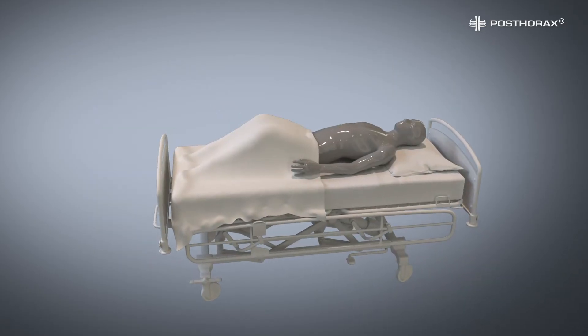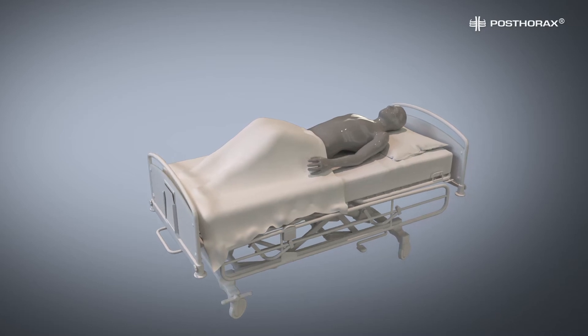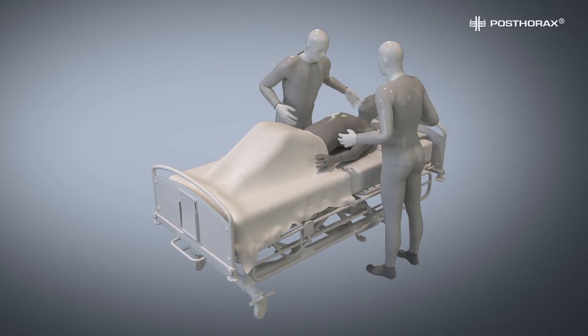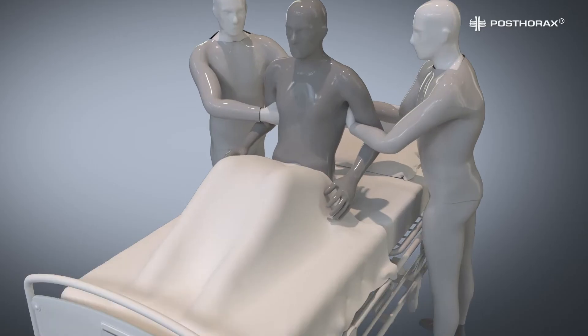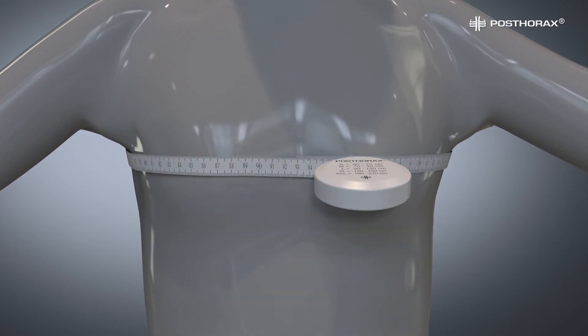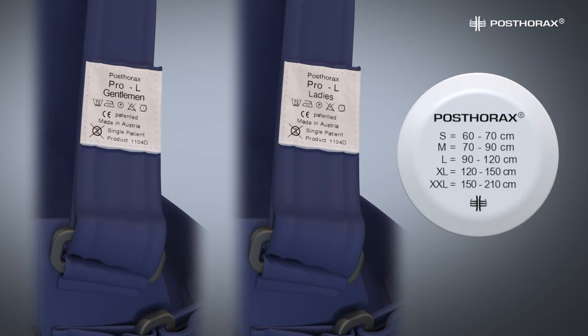Now we will adjust the vest for a reclining patient. If the measurement has not been obtained prior to the operation, lift the patient up and place a measuring tape around his back. Bring it forward directly under the armpits and have the ends meet in the center of the chest. With this measurement, refer to our sizing chart. Please specify either women's or men's model when making your sizing choice. Both models run from sizes small to double extra large.